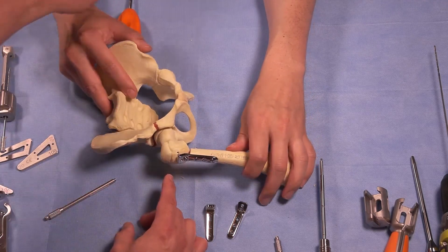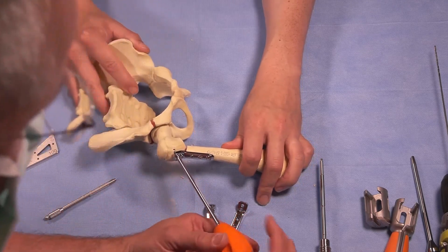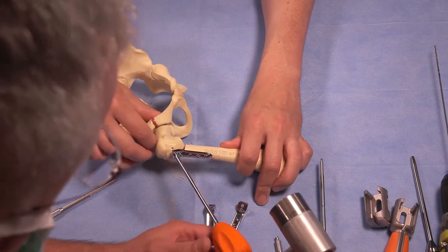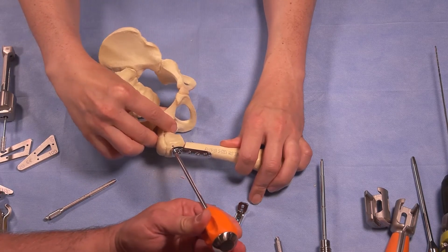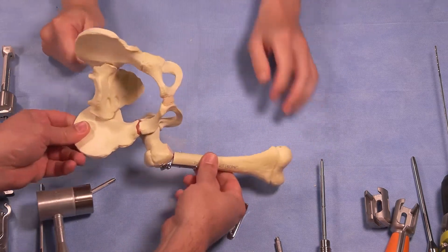To do the final impaction, you use the impacting device — put that in place and then use your mallet. With sawbones you want to make sure you don't explode it, but you can see that's your final impaction.